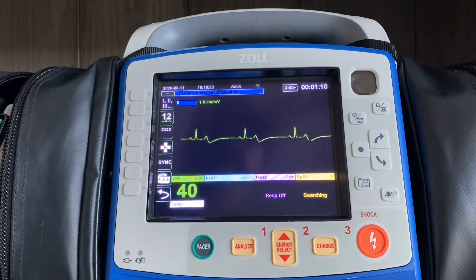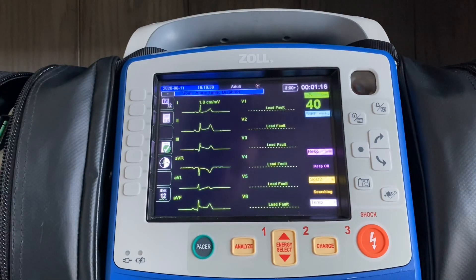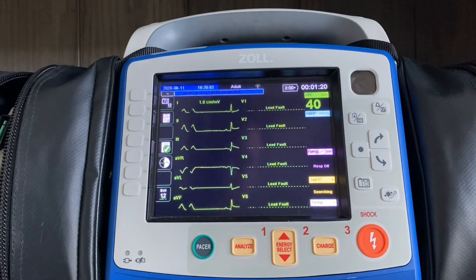Now we have a rhythm being presented in lead two via the limb lead cables. If I want to look at more than lead two, the easiest way to do that is to hit the second button down, labeled 12, which will bring me into my 12-lead menu. In this case, I only have my limb leads hooked up, so I'm only seeing one half of the 12-lead.